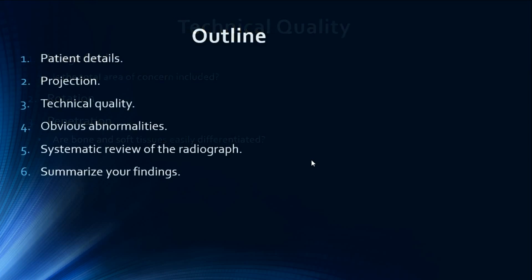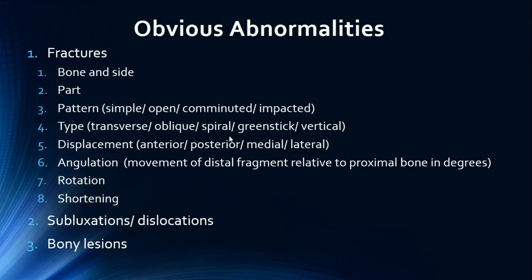Then we look at any obvious abnormalities in the radiograph. The most important obvious abnormalities are: first, fractures; second, subluxations or dislocations; and finally, any obvious bony lesions.